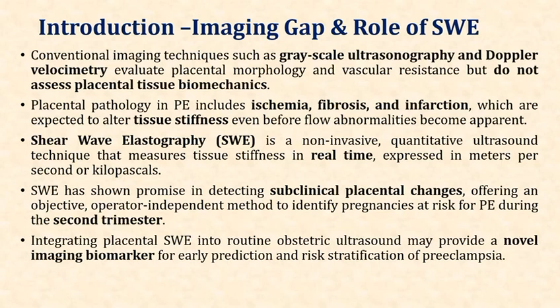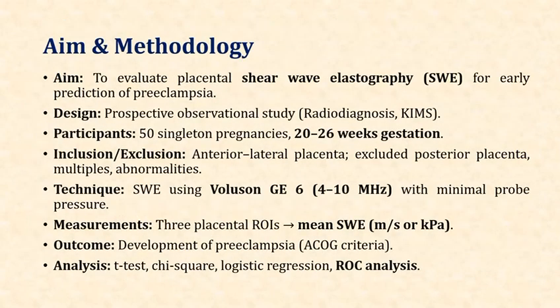Integrating placental shear wave elastography into routine obstetric ultrasound may provide a novel imaging biomarker for early prediction and risk stratification of preeclampsia. The aim of my study is to evaluate the placental shear wave elastography for early prediction of preeclampsia. It is a prospective observational study.